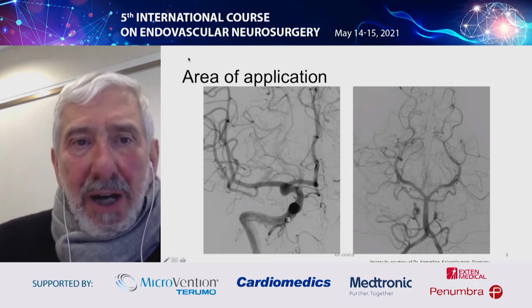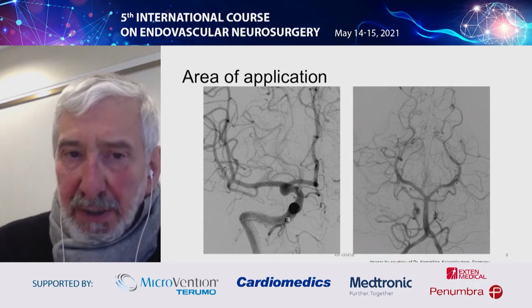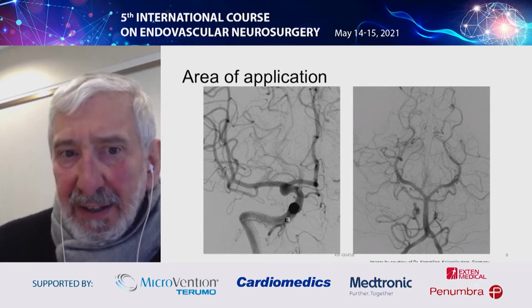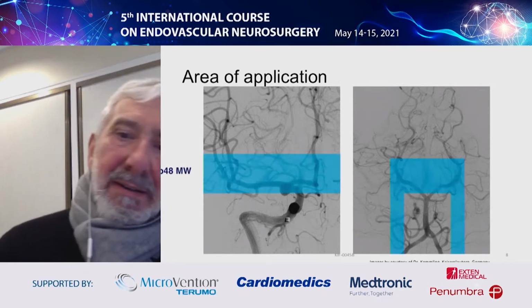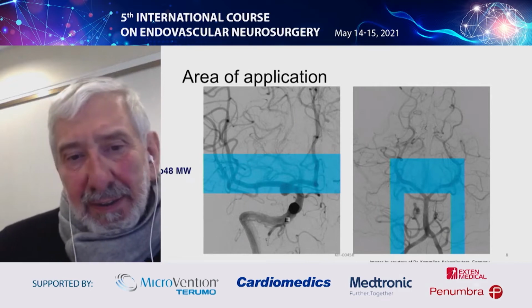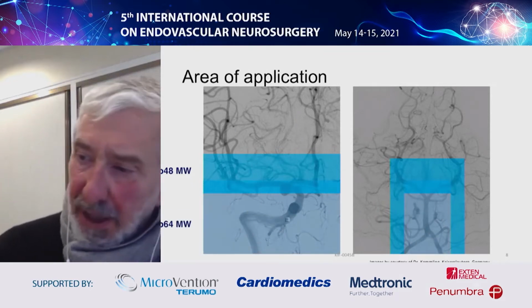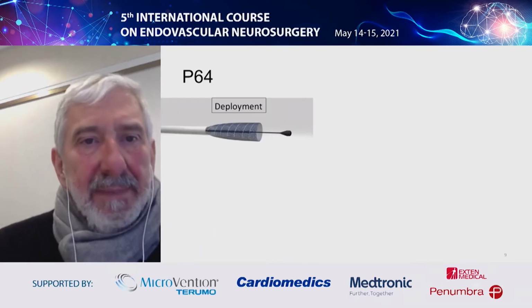So the area of application regarding P48 and P64. P48 is dedicated to distal vessels: MCA, AComA, PCA, PICA. And P64 is dedicated to larger vessels, ICA, basilar artery singularly.